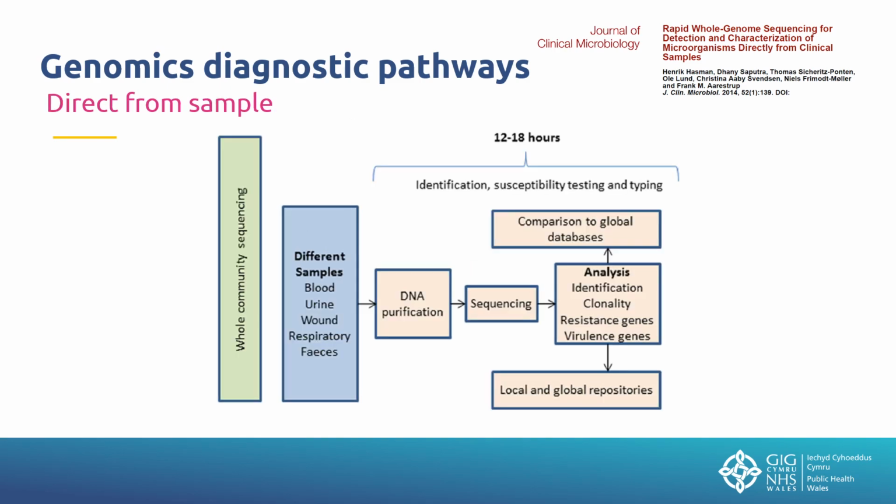And we are rapidly moving towards use of WGS directly from samples, and the impact of that is huge in terms of turnaround time. So we are talking less than a couple of days all the way from the sample arriving in the laboratory and WGS being performed and all of the analysis being available, so a huge potential impact.